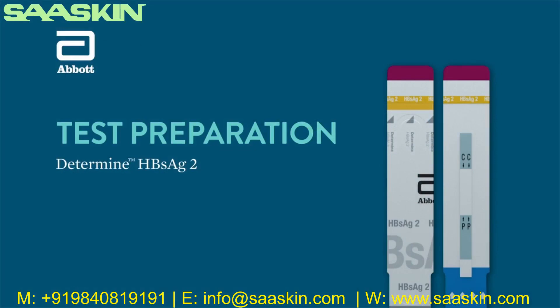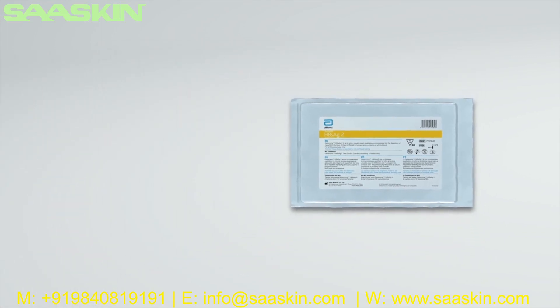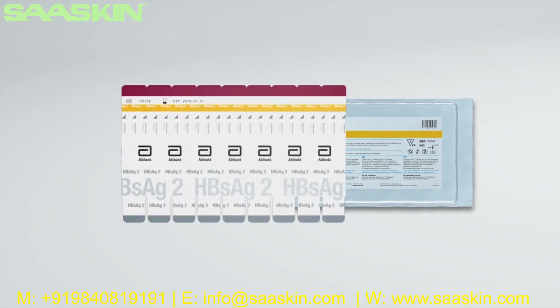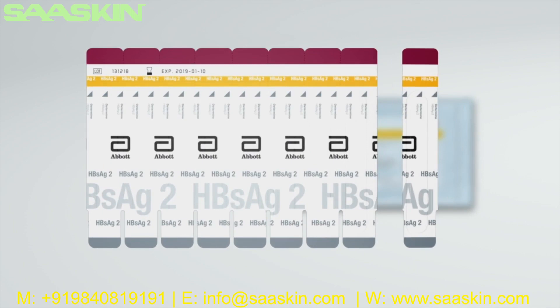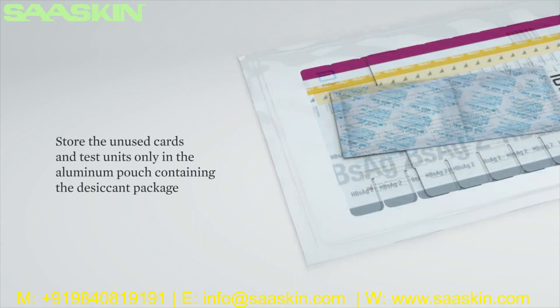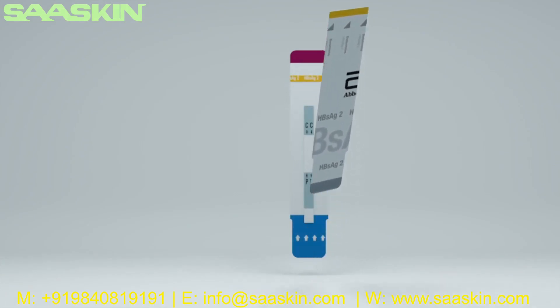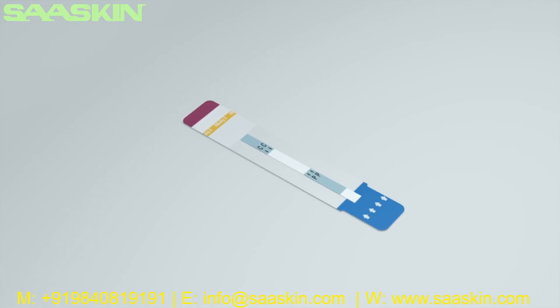Test preparation: Open the aluminum Ziploc pouch containing the Determine HBsAg2 test cards. Remove the desired number of test units from the 10 test unit card by bending and tearing at the perforation. Removal of test units should start from the right side of the card to preserve the lot number, which appears on the left side. Store unused cards and test units only in the aluminum pouch containing the desiccant package. Carefully close the Ziploc so that the cards are not exposed to ambient humidity. Remove the protective foil cover from each test unit and lay it flat on a flat surface. The test should be initiated within 2 hours after removing the foil cover. Do not touch the sample pad.